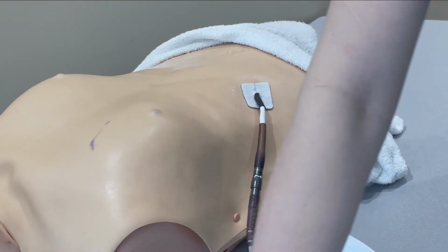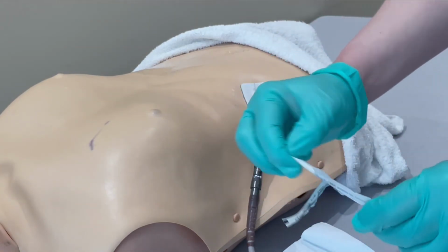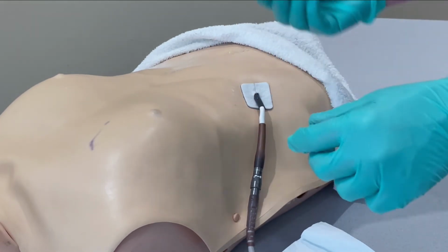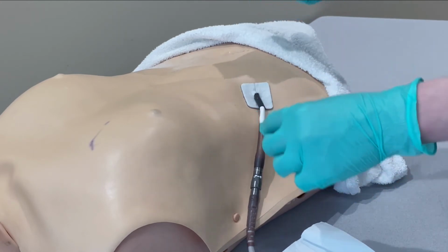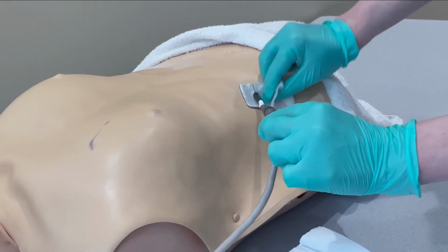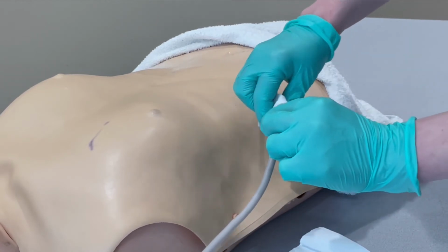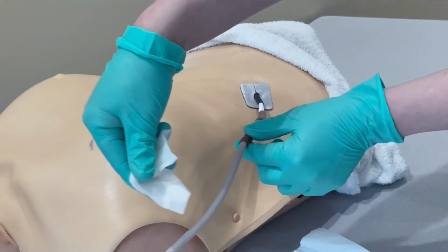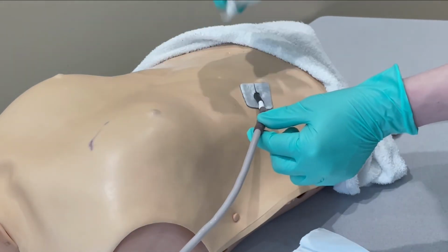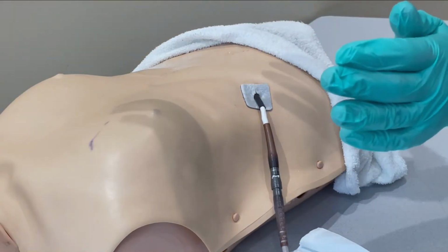We can now get our saline wipe, and we're going to open this, and we're going to use this to 1, clean the dressing, and 2, to get the disc a little bit wet. Getting the disc wet activates the silver, which is what's going to protect you from infections. So using your clean glove hand to lift your driveline, you're just going to squish a little bit of fluid onto that disc, and then starting from the first exit site, you're going to clean all the way out, getting it nice and clean. Now, we do not want to go back and put this back in, right? Because then we'd be taking all of these germs and putting them right into your family member's driveline site. So once we're done with this saline, we can just toss that away.